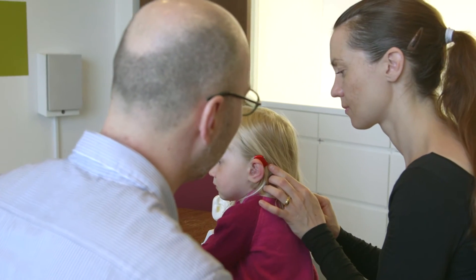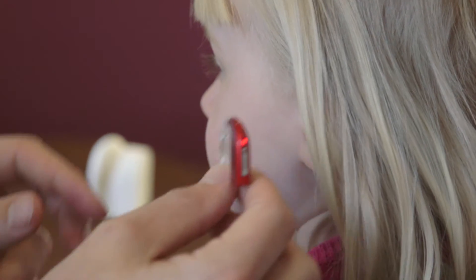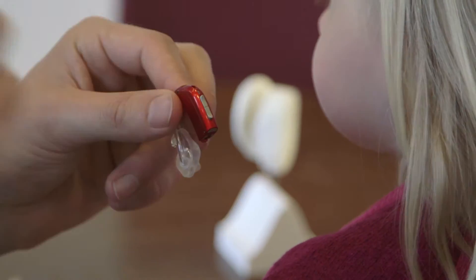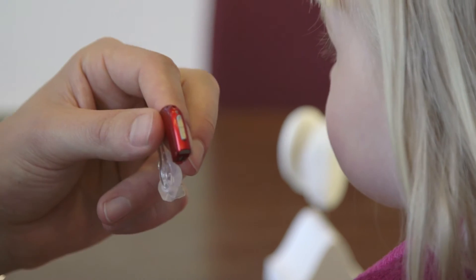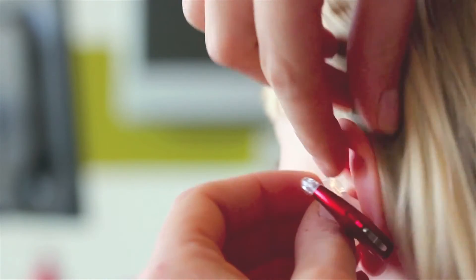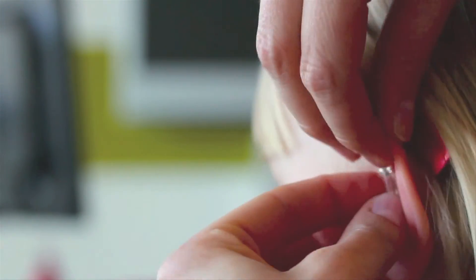Smart Fit Trainer makes a measurement when you first turn on the hearing instrument. It evaluates the feedback path, leaving the LED on until the ear mould is properly inserted in the ear. During the measurement the LED light will be on. Smart Fit Trainer makes up to 7 consecutive measurements, allowing an ongoing adjustment of the ear mould.